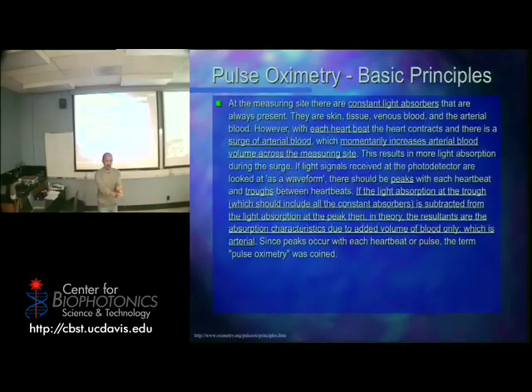They might have had a little device measuring the light absorption, taking the blood as they're measuring it, then sticking the machine on a few minutes later, getting a reading, and they had to figure out what change in light absorption corresponds to a certain percentage of oxygenation. And they had to do that probably with thousands of people to validate this device, to make sure that the values they were getting were accurate.